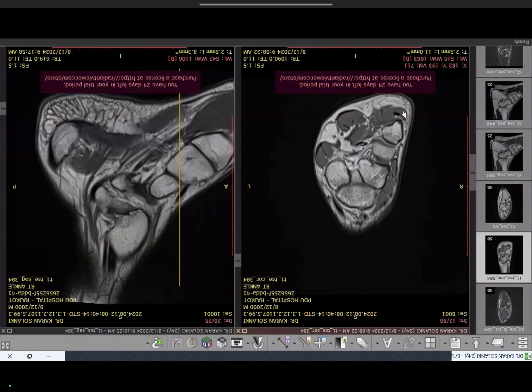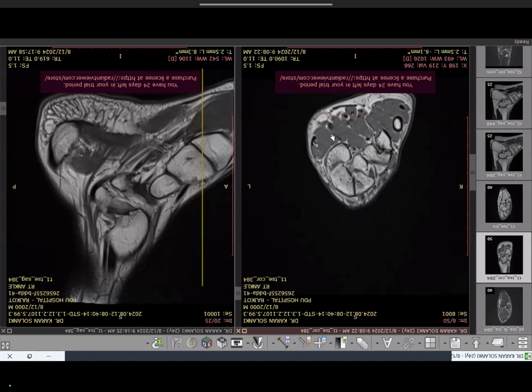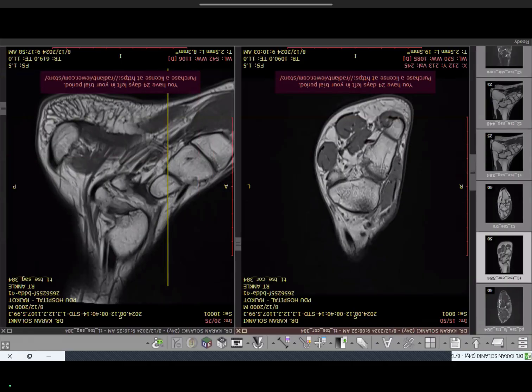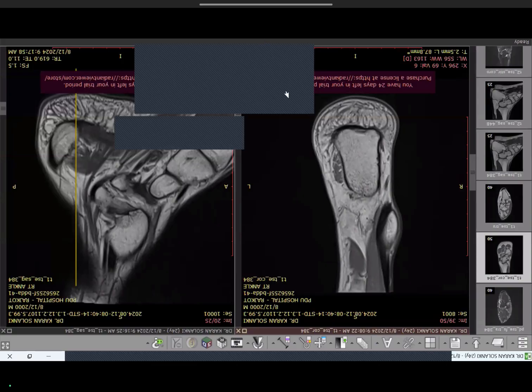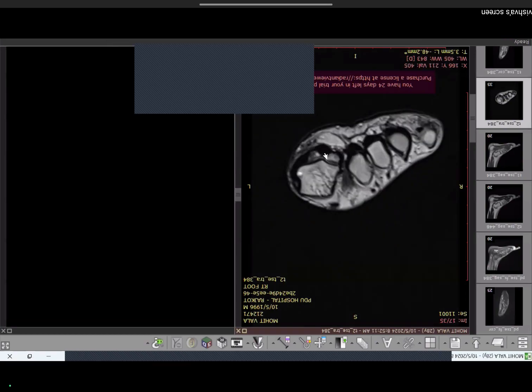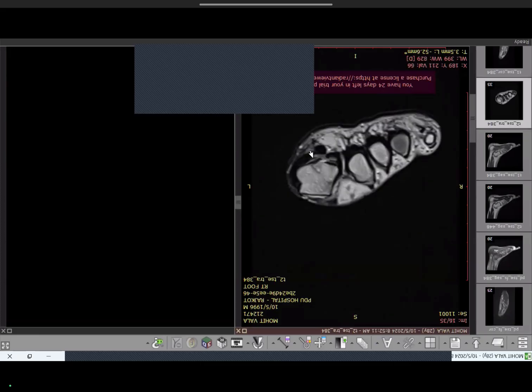Flexor hallucis brevis is in the third layer, and the sesamoid bones are visible there. In clinically what you need to remember: always look at the two sesamoid bones for any edema, fracture, or sesamoiditis. The flexor hallucis longus tendon passes through these two sesamoid bones.